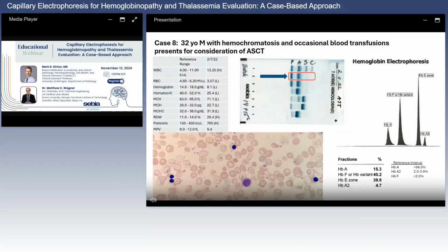So this patient has hemoglobin E and some hemoglobin A, and quite a bit of hemoglobin F and elevated A2. So this raises a few possibilities. We could talk about this possibly being a heterozygous hemoglobin E or an E trait. However, a lot of this data would argue against that simple explanation, given that we have elevated hemoglobin A2 and what appears to be a pathogenic disease, which E trait by itself is usually silent.